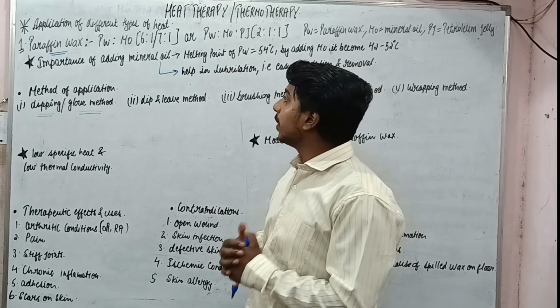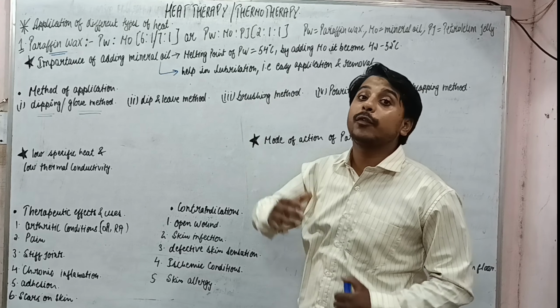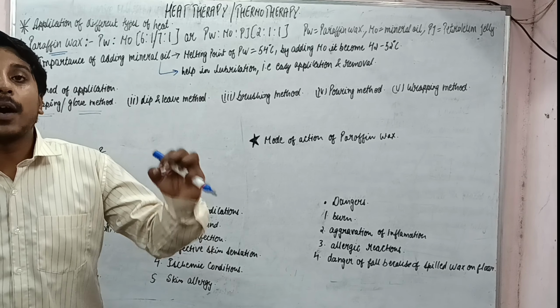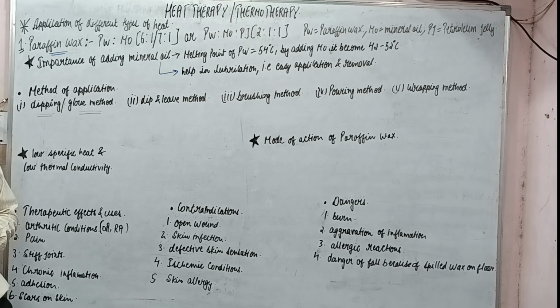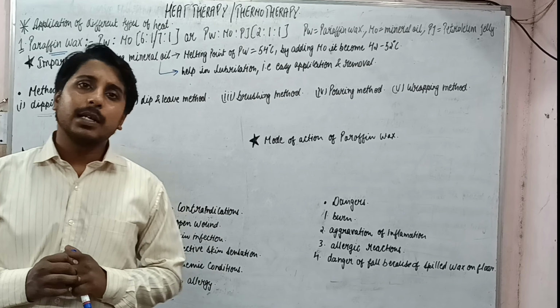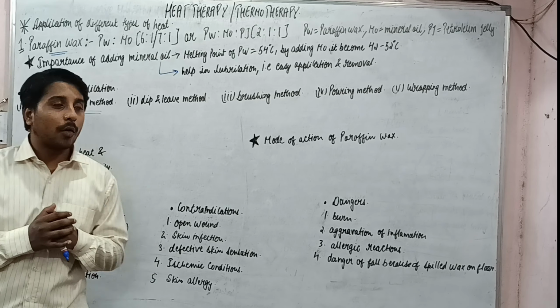So now our topic of interest is the application of different types of heat, among which we are going to study paraffin wax. Paraffin wax is one of the most commonly used heating modalities, and it is easy to apply and safe for us.